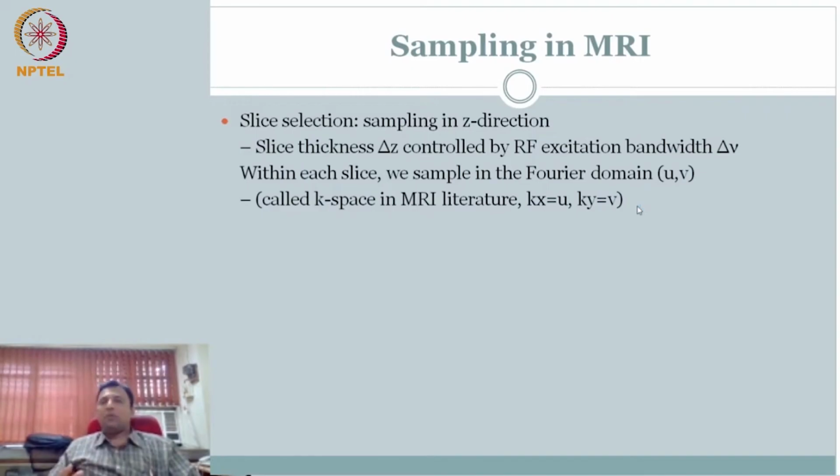Each time we think about sampling, we introduce the concept X of t or Y of t, the signal in the time domain, and we say, sample it at twice the highest frequency to beat the Nyquist, right? And that's how we do the sampling concept. Here it is kind of weird. The signal that you are recording, as we saw, is actually the frequency spectra. So what you are recording is a sampled version of your frequency spectra. So that's where the confusion may start to arise.